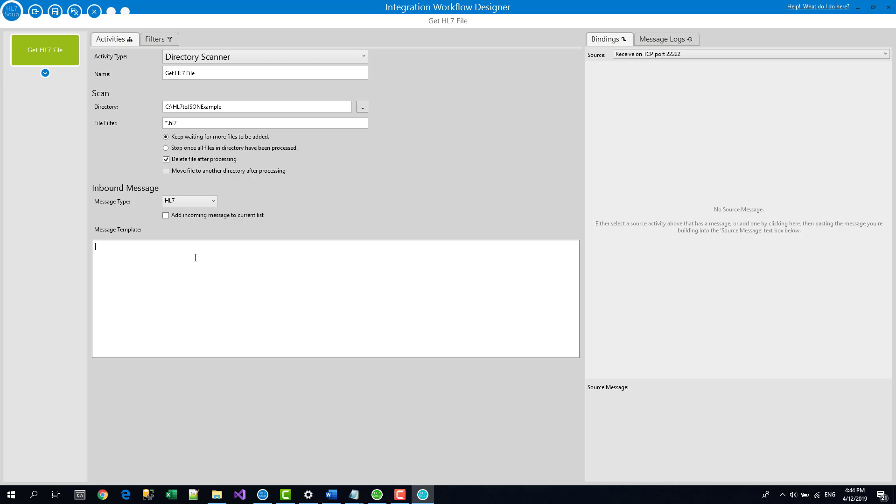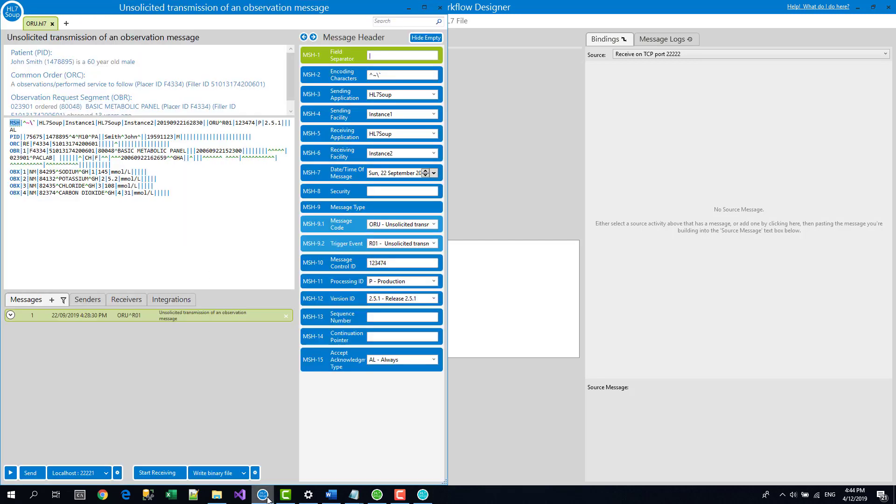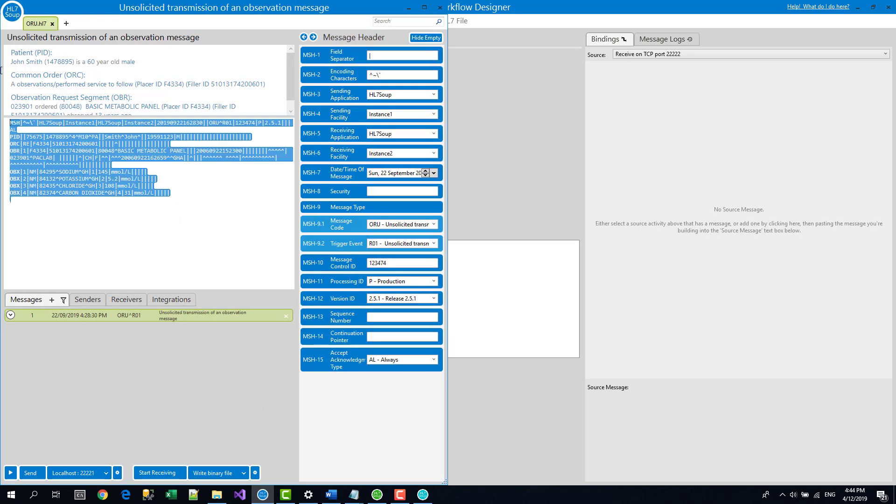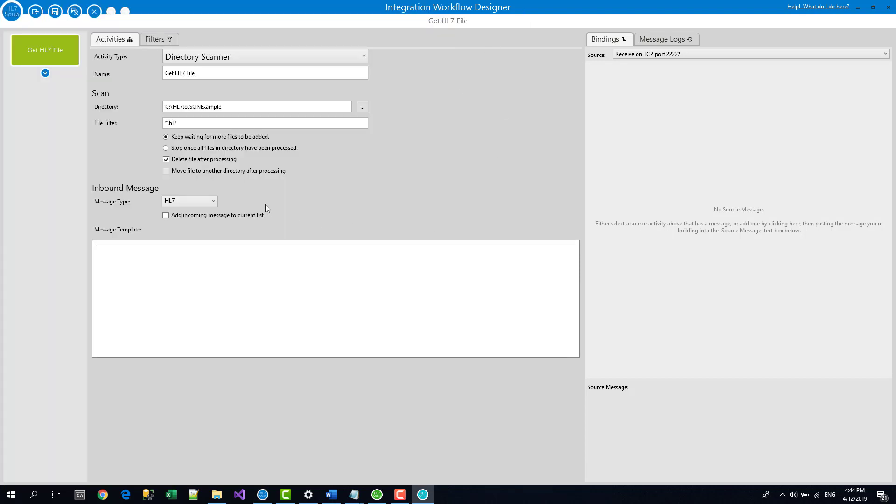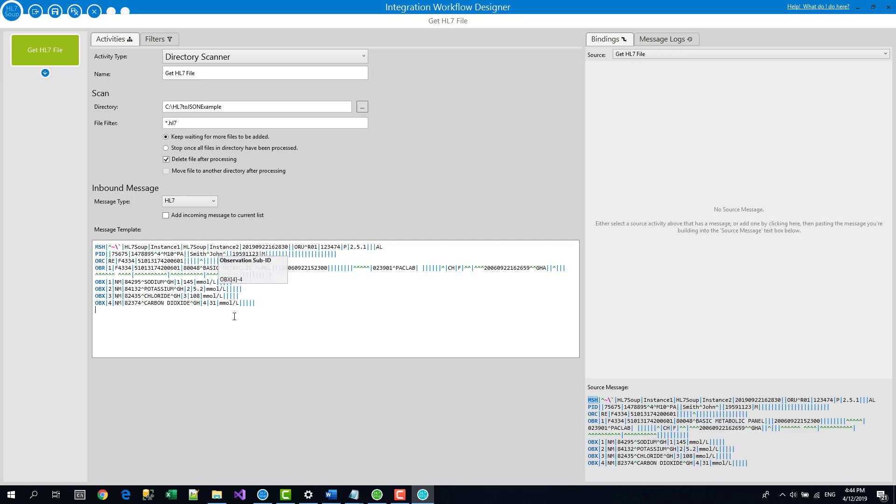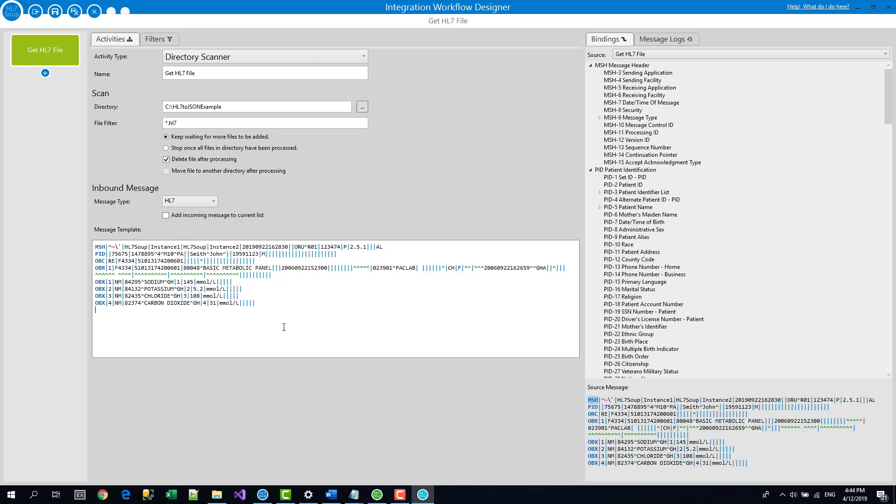The message type that we've got coming in is an HL7 file. And finally, we need a message template. Now, the message template is just an example of what that message is going to look like. So I actually have this one, which I prepared earlier. This is just taken from the HL7 Soup editor's sample files and I'll paste it in here.